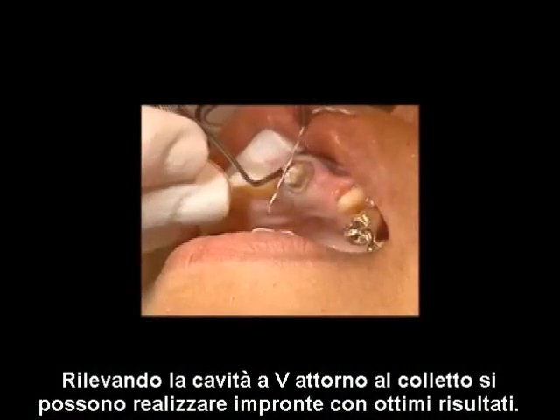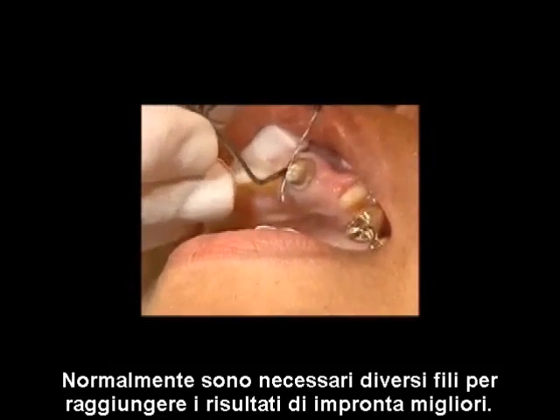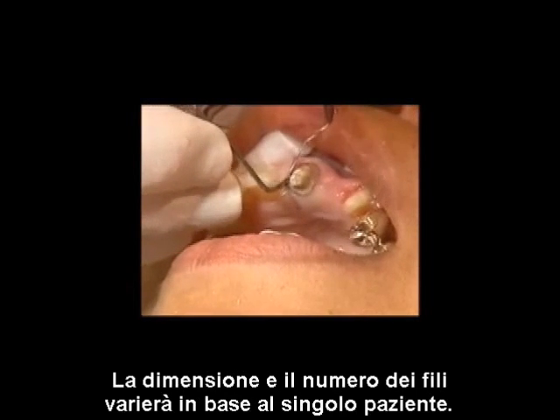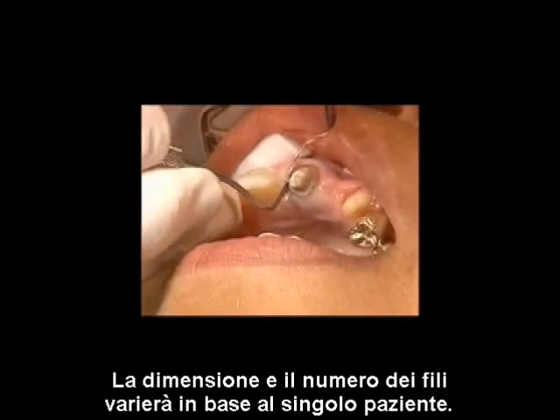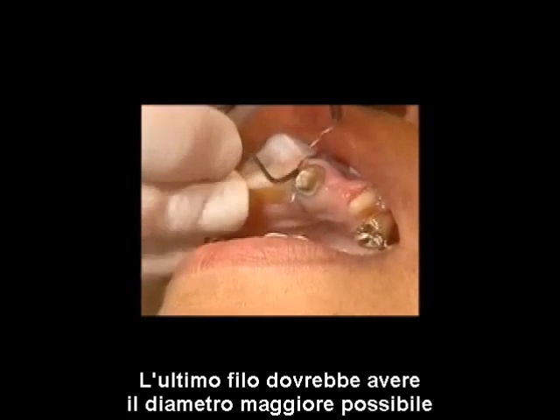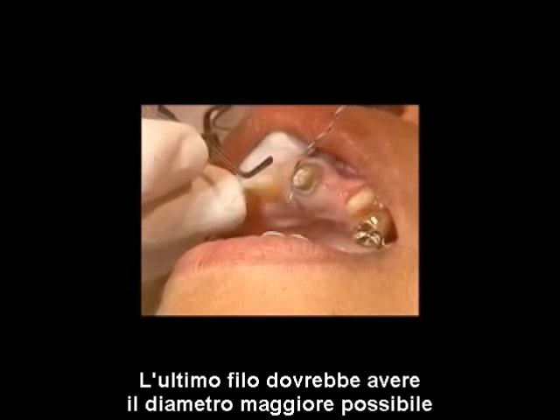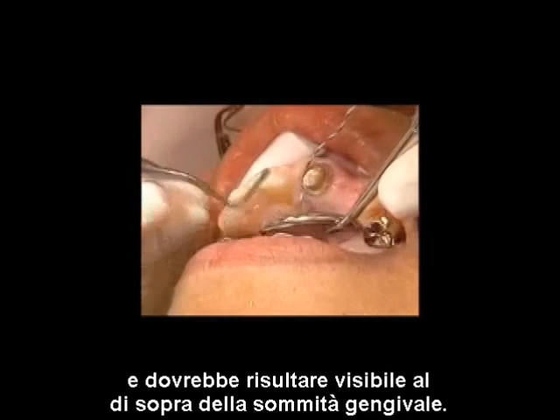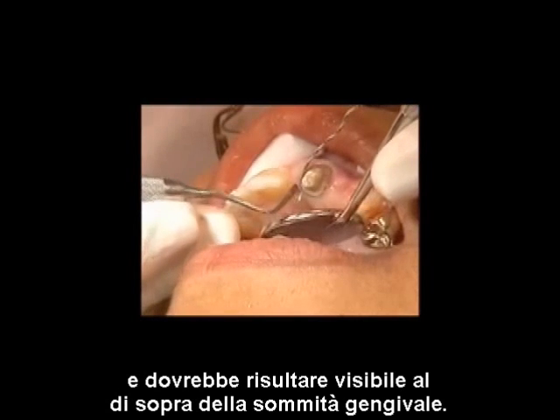A V-shaped sulcus leads to successful impressions. Multiple cords are usually needed for optimal impression results, and the size and number of cords will vary with each patient. Pack successive cords in ascending order. The last cord placed should be the greatest diameter cord possible, and should be visible above the gingival crest to prevent collapse.